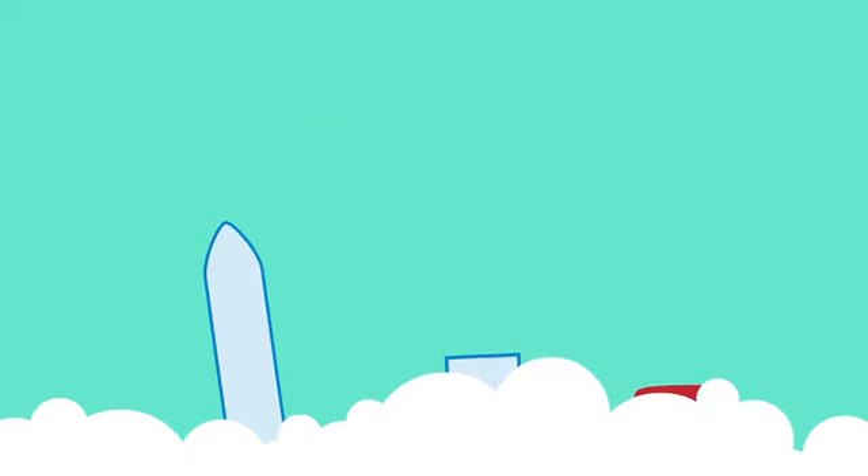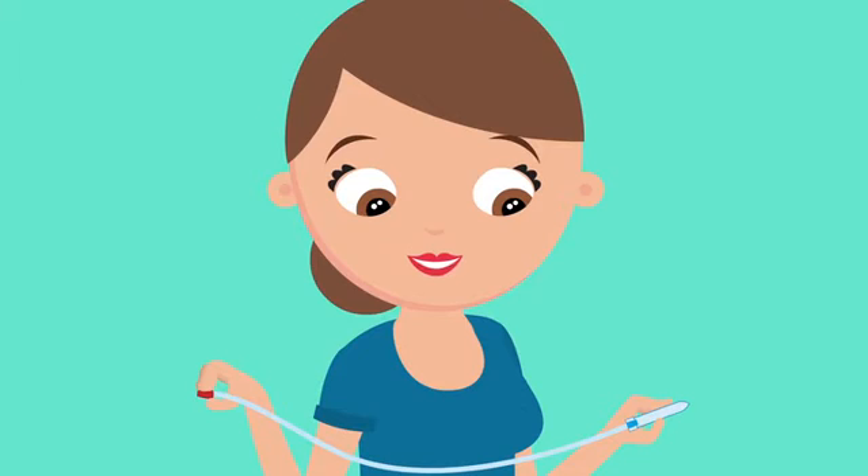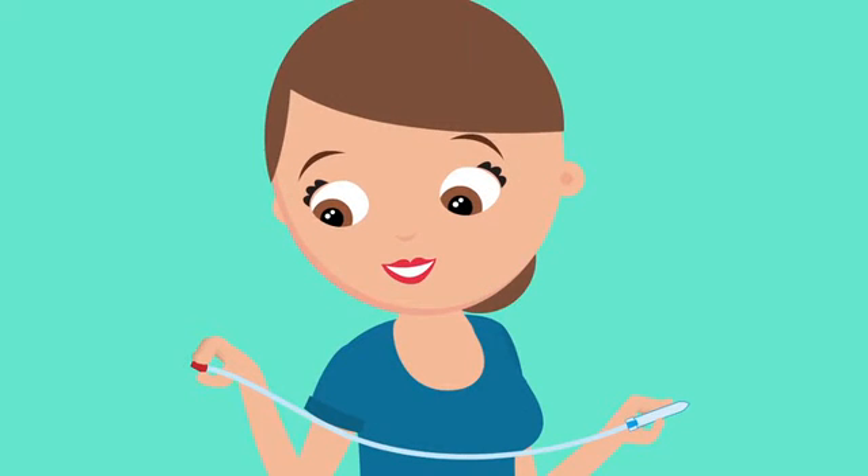Now, toss the filter and clean the boogies out with soap and water. Snap the pieces firmly back together, listen for the click, and you're ready for your next snot sucking call of duty.